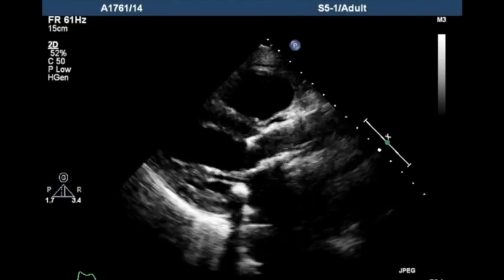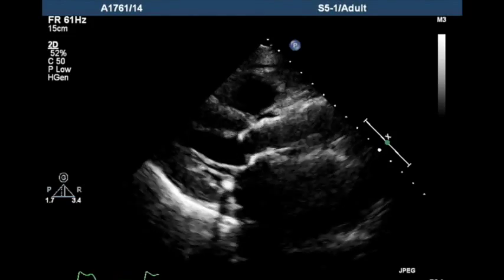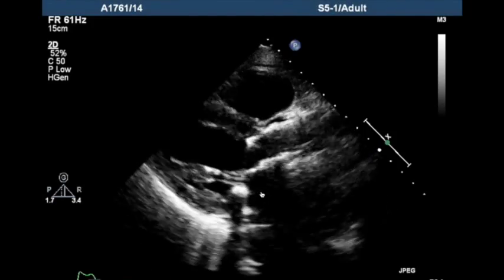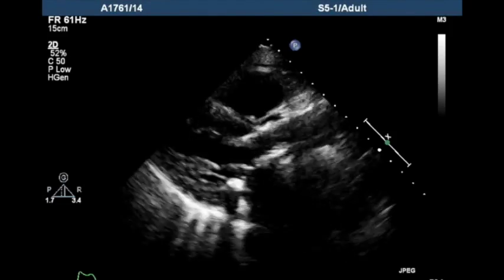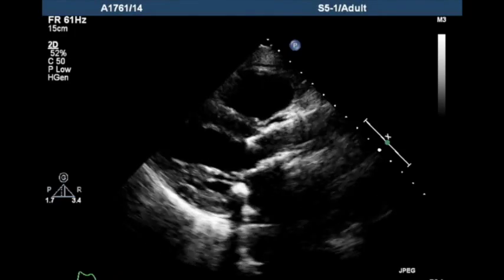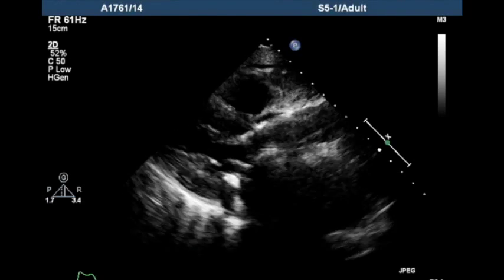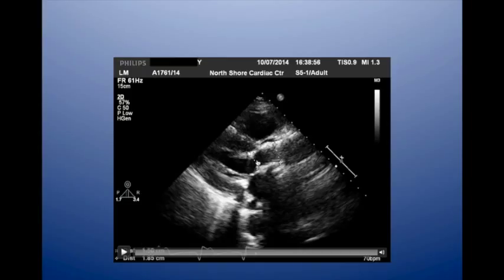You'll recall we got an LVOT diameter of 2.0 cm earlier, but here I think it's measured at 1.5 cm, which is clearly wrong — this is measuring inside the stent prosthesis rather than the LVOT. Here's another measurement around the annulus, well inside the prosthesis.